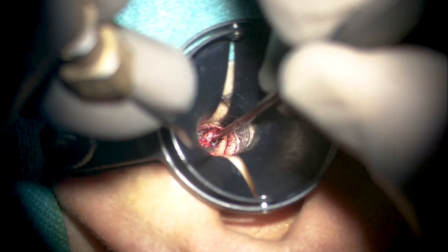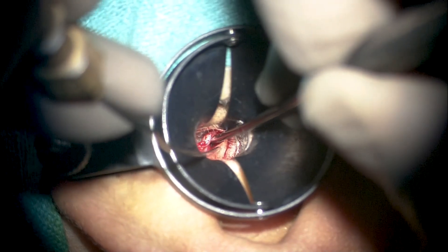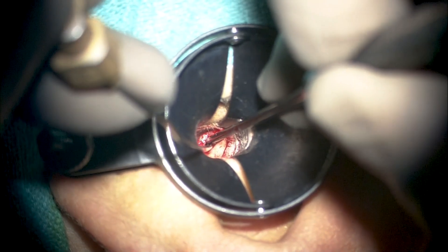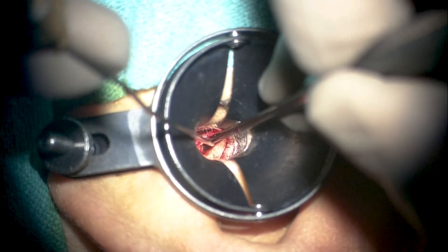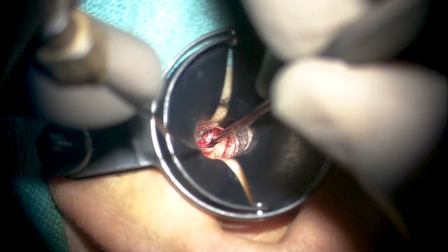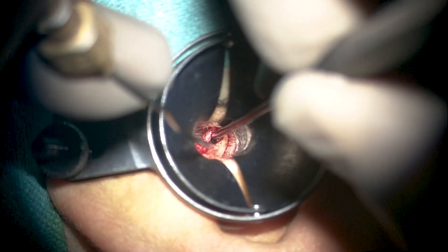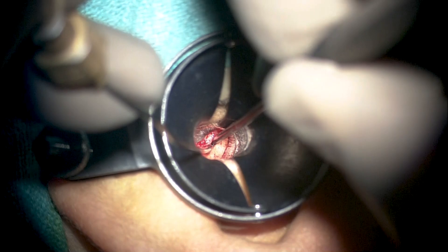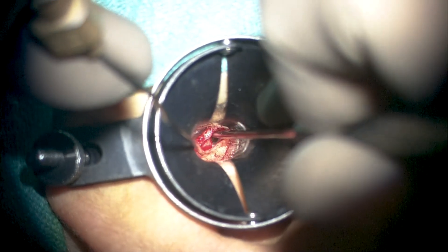The goal of this surgery is to excise or elevate the retraction pocket — elevate it completely if possible — and then excise and augment the posterior weak portion of the pars tensa using a full-thickness cartilage graft from the tragus. A limited atticotomy could be considered if one feels during surgery that the epithelium is indeed going towards the attic region, though in this case it probably is not.